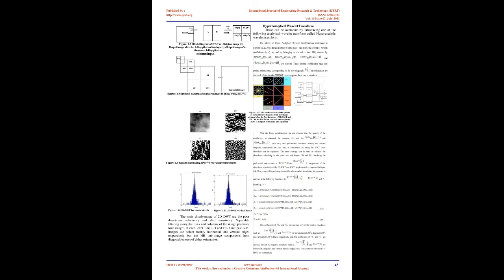Although bilateral filtering is a nonlinear technique, it is non-iterative, local, and straightforward. The nonlinearity arises from the nonlinear relationship of picture element values of a picture. Our proposed bilateral filter comprises two component filters, a domain filter and a range filter.